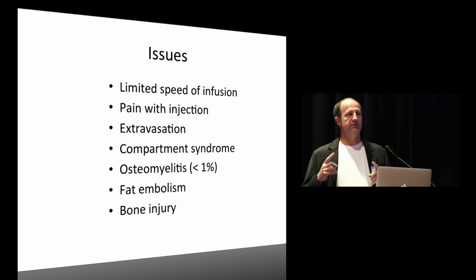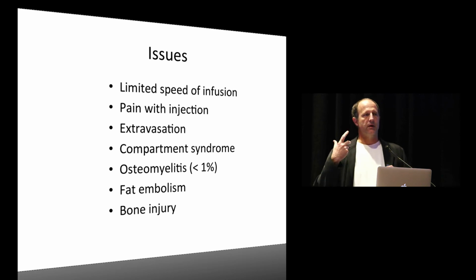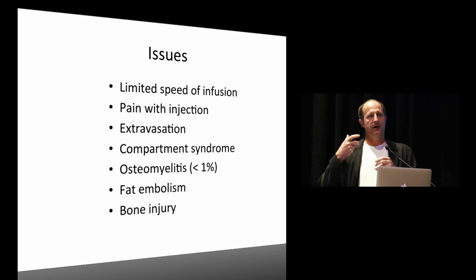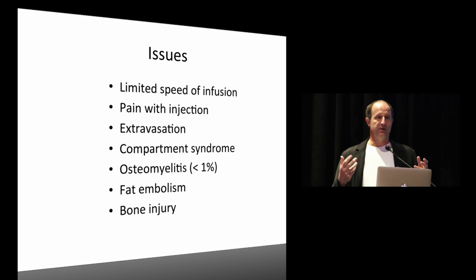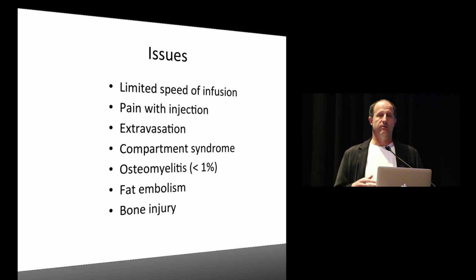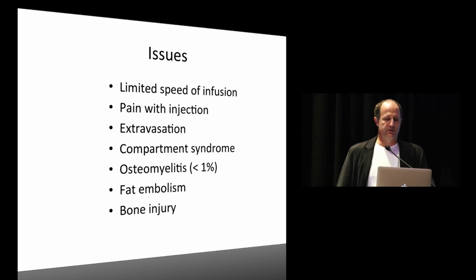Now, there's pain with injection. I know like they said, it was only a 2 or 3 level pain for them to place it. But the other thing is when you inject large volumes quickly, imagine bone pain like a tumor in a bone causes people a lot of pain from the stretching. Well, it's the same thing when you do the injection. That injection causes a lot of pain as it stretches the bone. So, that would be one thing about using it for an awake patient for induction. You better hold them down when you do that first injection because you don't want them thrashing around. And then there's also the issues with extravasation, as I talked about.